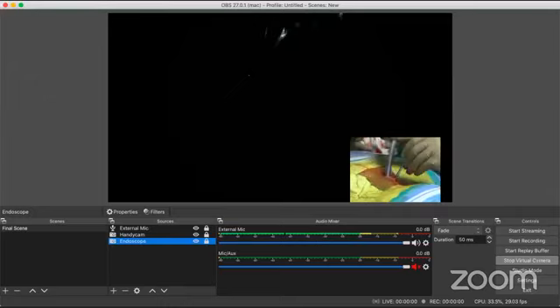So we are going to bring in the C-arm and I'm going to show you what I'm doing with my dilators. This is the most harmless maneuver, but it helps lift the entire muscle bed up. Now, can we have a shoot, please?